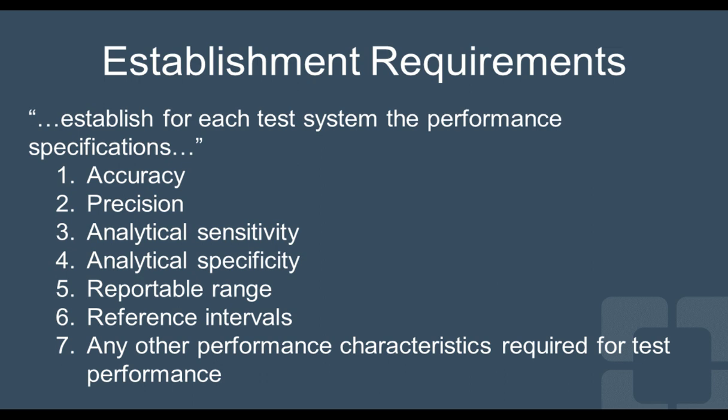One common example I'll utilize is stability. Of course, you need to know how long from draw to analysis you can wait before you'll have degradation of the compound.